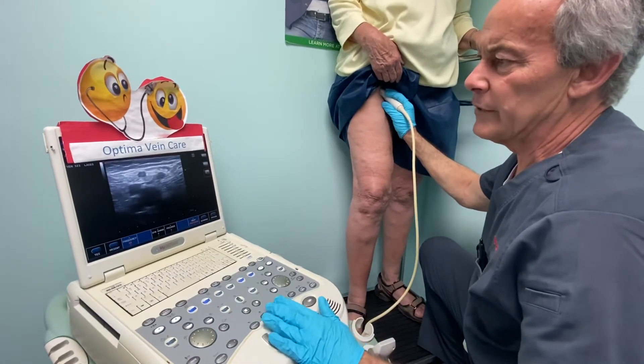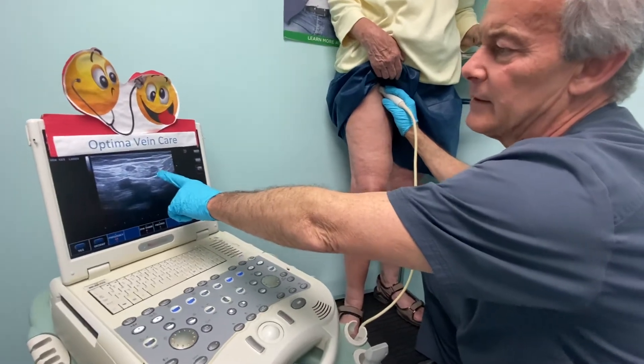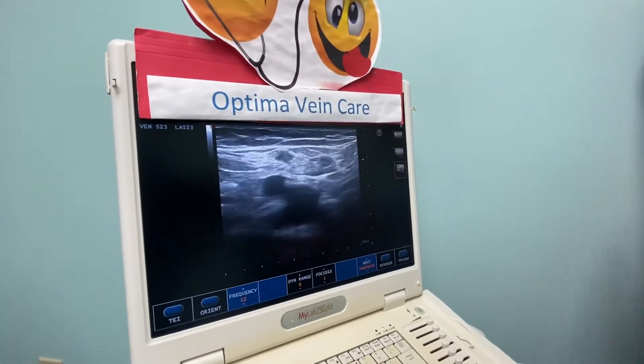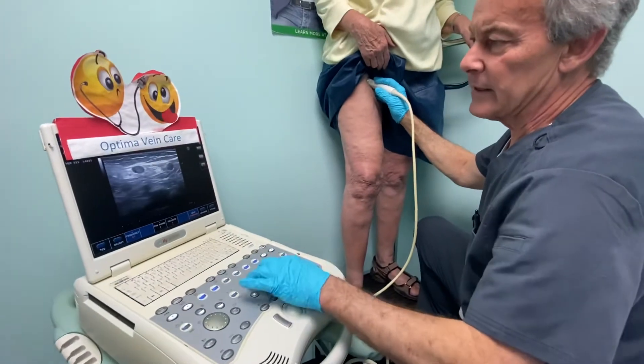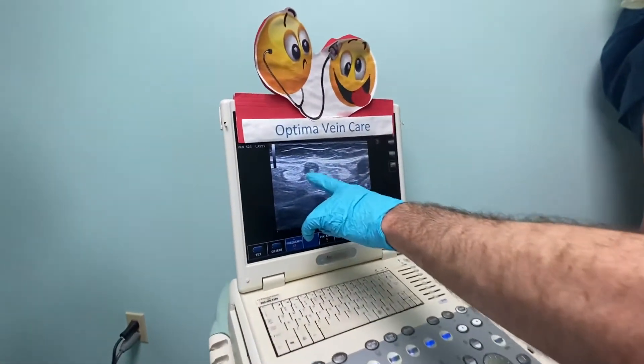Let me get my focal point up here. This is a good comparison — the great saphenous vein was not treated, but the anterior duplicate was. So obviously when I compress, the anterior duplicate will not compress. You can also see what the glue looks like in here — it gives kind of a hyper-echogenic image inside the vein.